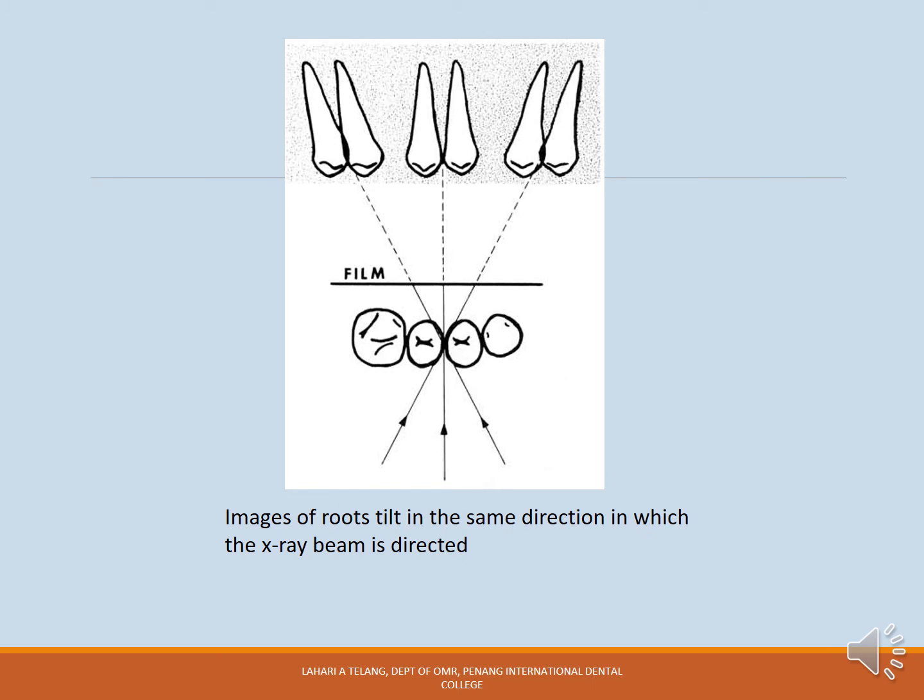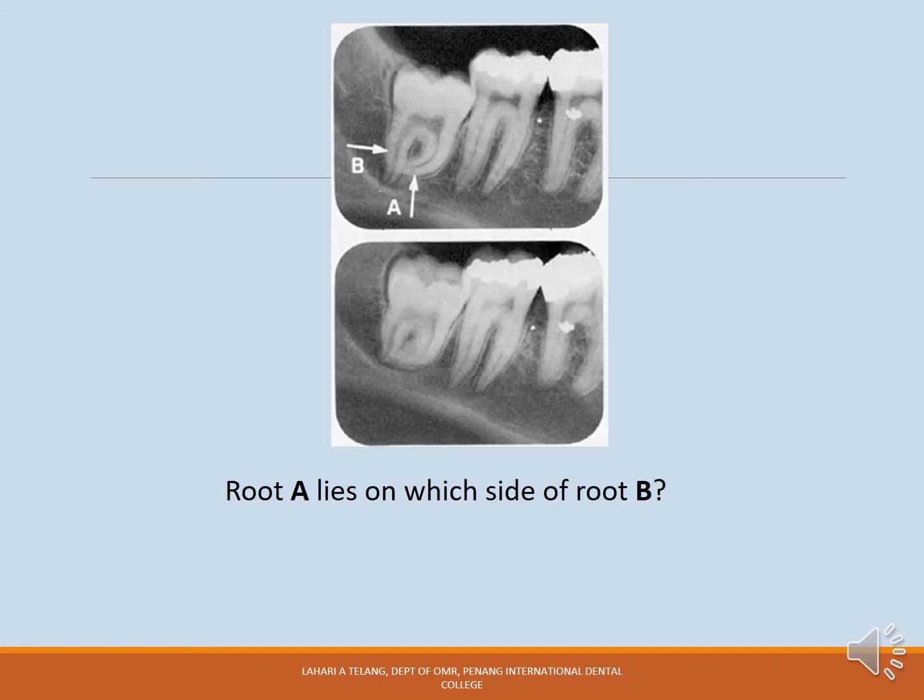So another interesting finding is that the images of the roots tilt in the same direction in which the X-ray beam is directed, and that's not obvious because you're trying to make a horizontal shift. Let's look at this radiograph.